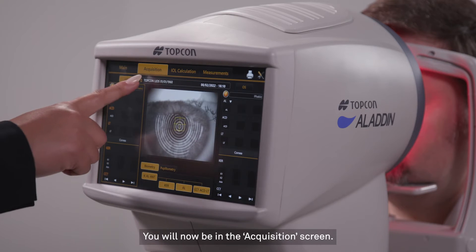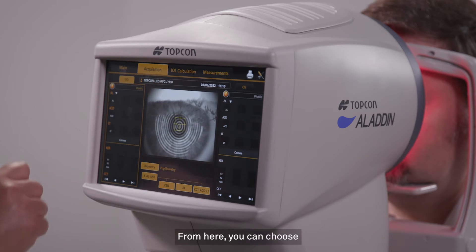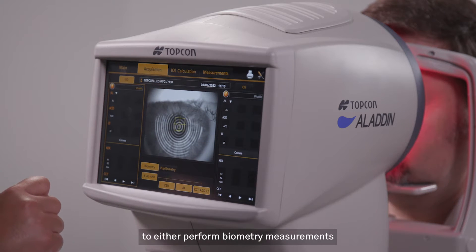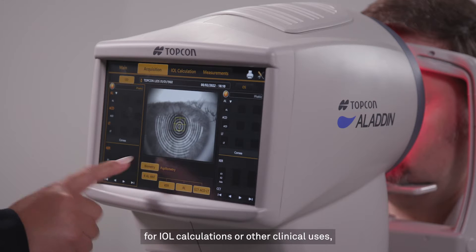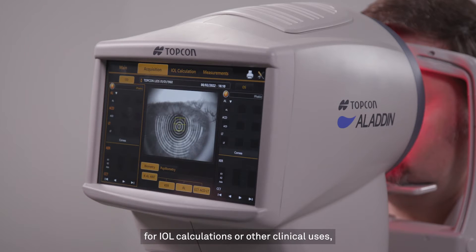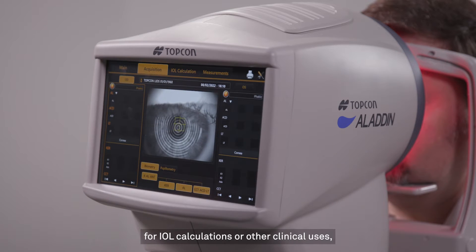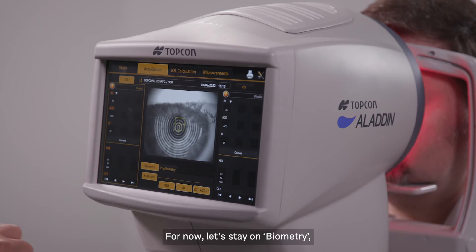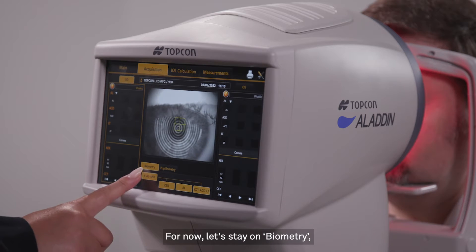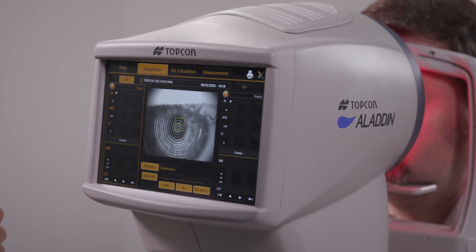You will now be in the acquisition screen. From here, you can choose to either perform biometry measurements for IOL calculations or other clinical uses, or pupillometry measurements. For now, let's stay on biometry, which is the default setting.